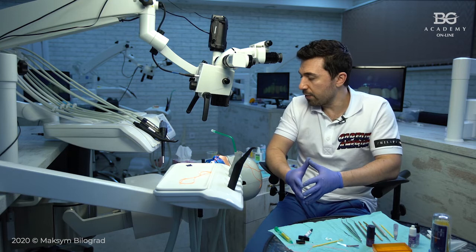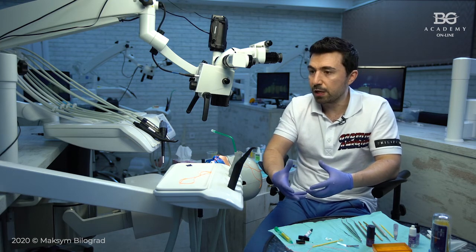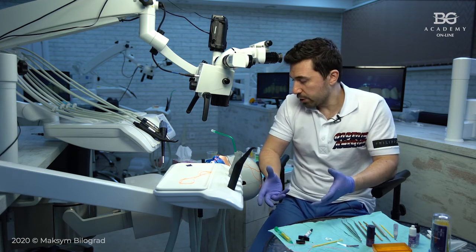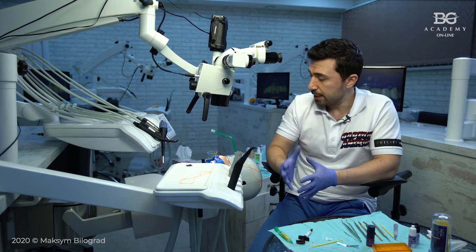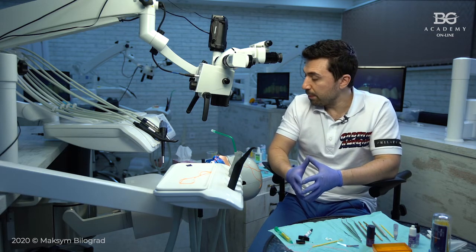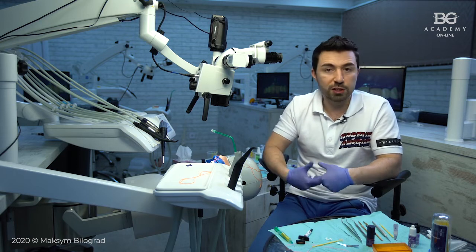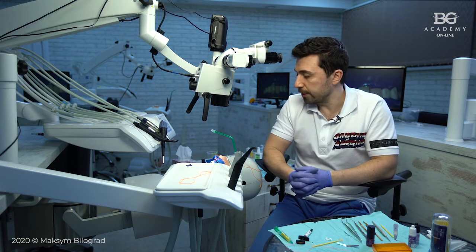Okay, and there are no huge advantages and benefits of paste composites over highly filled flowable composites. So basically I prefer to utilize highly filled flowable composites to cement my veneers. Light curable materials can be used with any bonding system that you utilize, so you don't need a special bonding system for a special light curable composite.